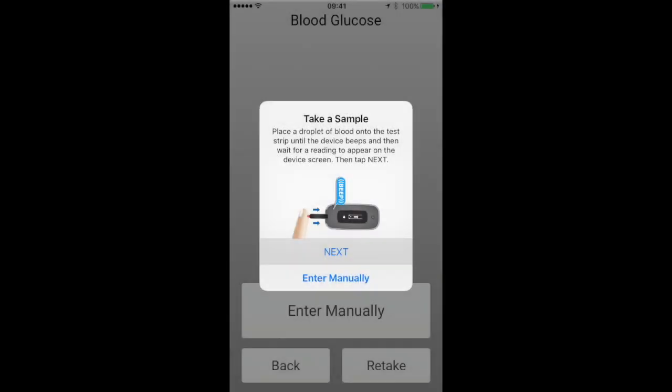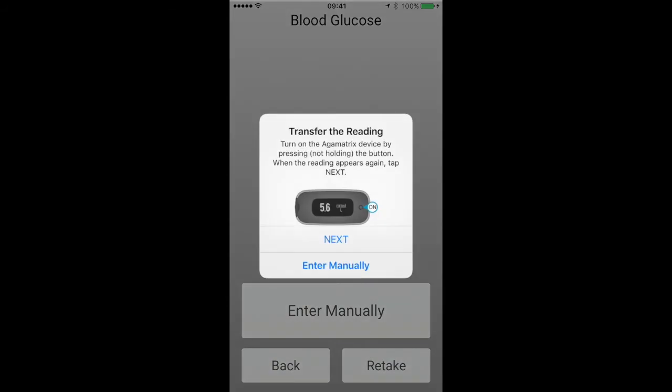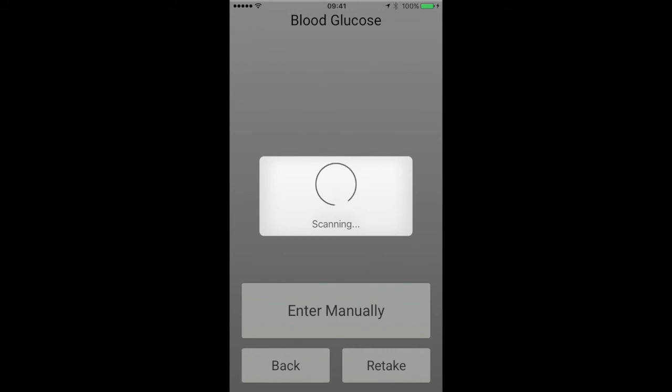Once the sample has been correctly taken, you will be instructed to turn off the device by removing the test strip. The app will automatically upload the data from the device to the app, and you should see the same reading displayed on the app screen as shown in the next example.